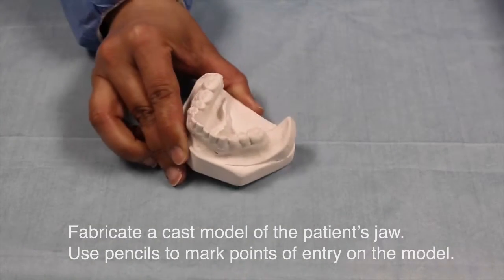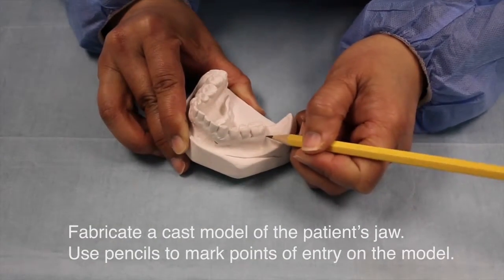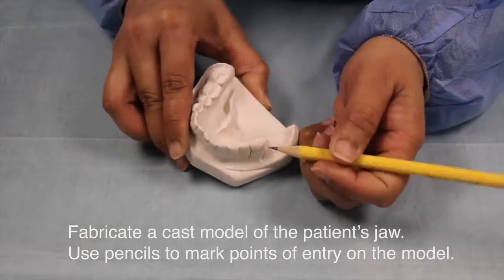Fabricate a cast model of the patient's jaw. Use pencils to mark points of entry on the model.